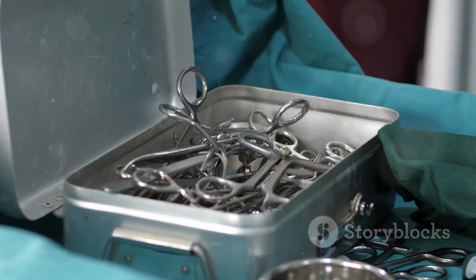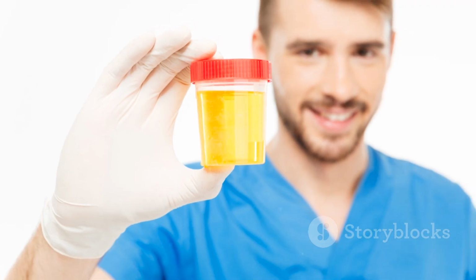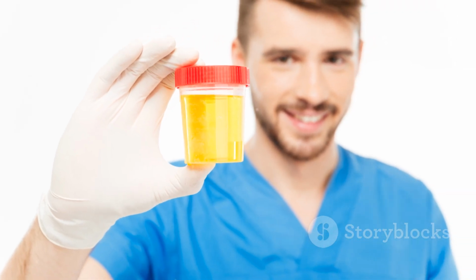Let's get started. First things first, the best time to collect a sputum specimen is early in the morning. Why, you ask? Well, that's when the sputum has had time to accumulate overnight, making it easier to collect a good sample. This is crucial for obtaining an accurate diagnosis.